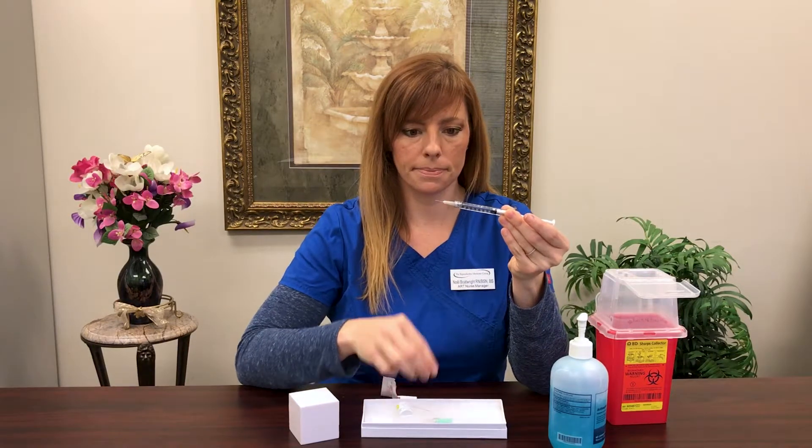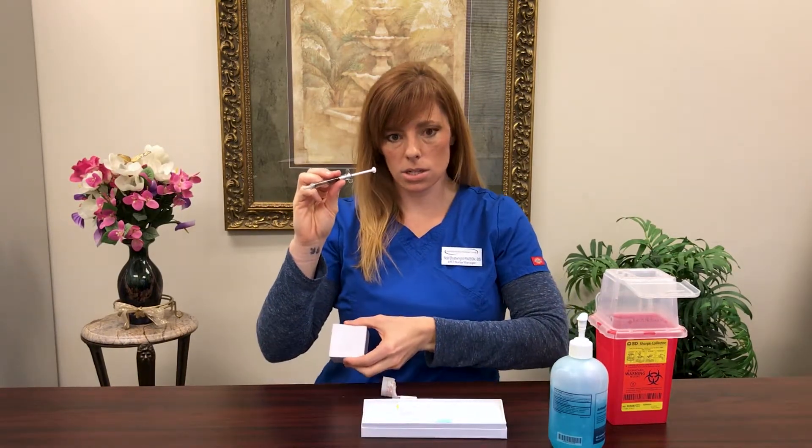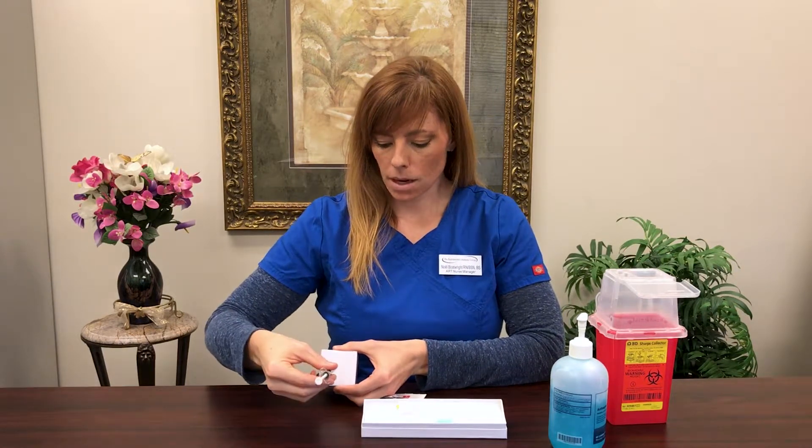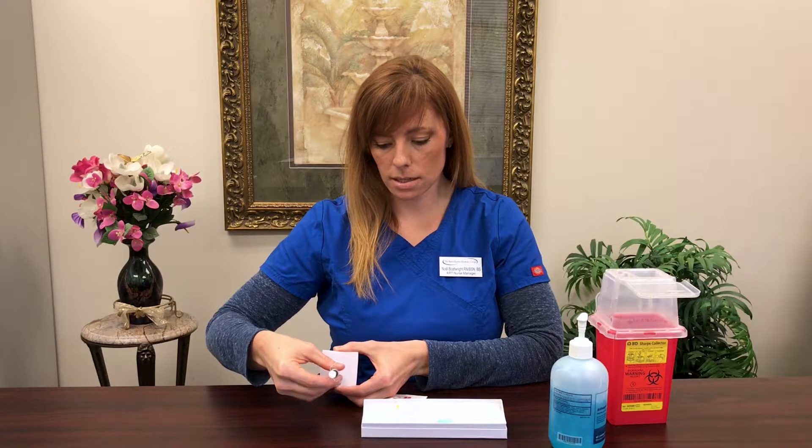Pull off your safety cap. Once your skin is dry, you're going to pinch the top of your skin just over your belly, around your belly button. Go directly into the skin as you're pinching. Push all the medicine into your syringe, pull out your syringe, and dispose of it directly into your sharps container. That's all you need to know.